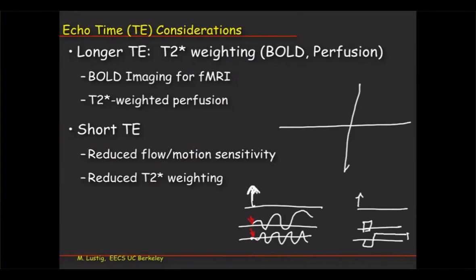And then your echo time ends up being here. And so you get more sensitivity to both T2 star as well as motion sensitivity. Anyway, so the notion is that you actually have to go out in K-space, right? And then collect this line. And then you go out in K-space and collect the second line. So the time that you cross the center of K-space takes a long time. And the idea is how to shorten it, even for Cartesian.